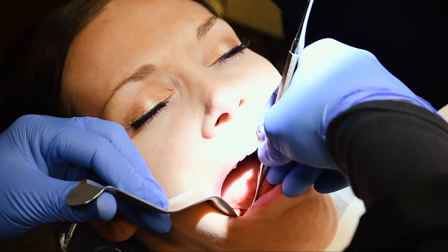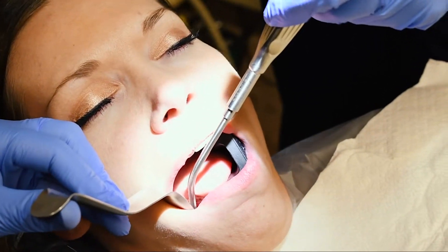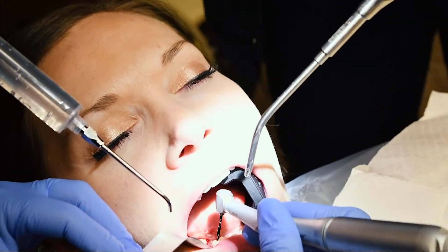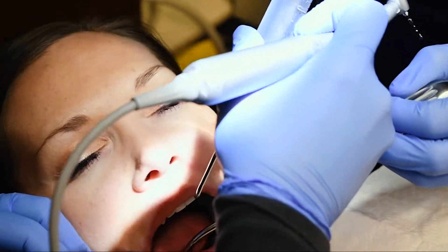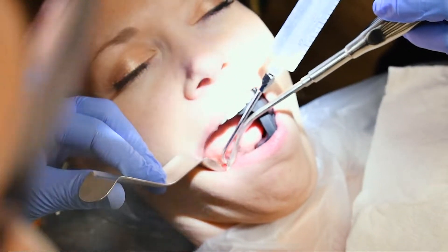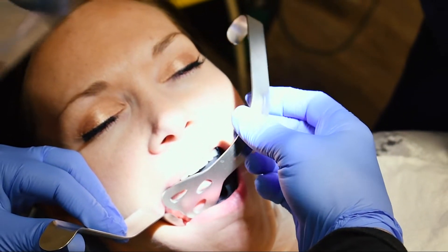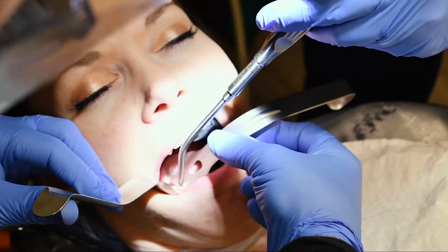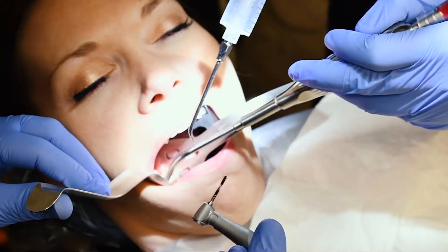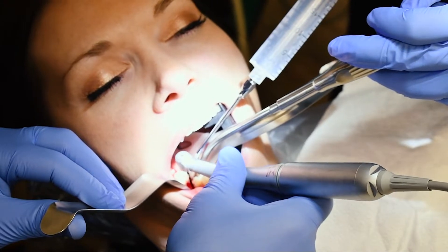Looks good — nice and healthy. Now you'll get lots of irrigation, you're going to feel some vibration. I'm going to use suction to retract the tongue — in fact I'll put just a little tongue retractor in to settle it right there and keep the tongue out of the action. We're shooting for a 5.0 by 10 millimeter implant in this area.